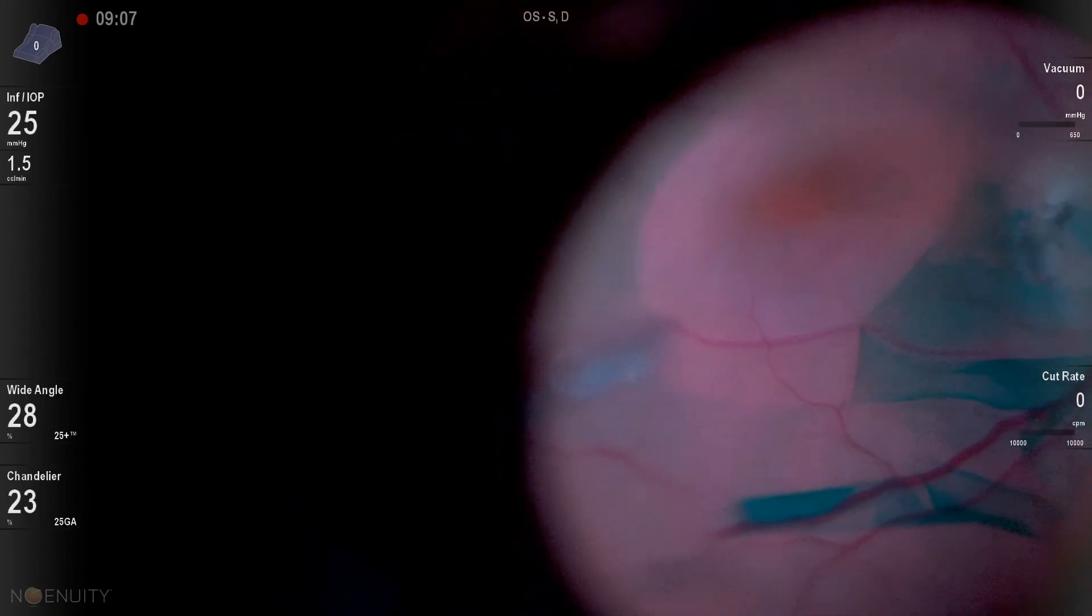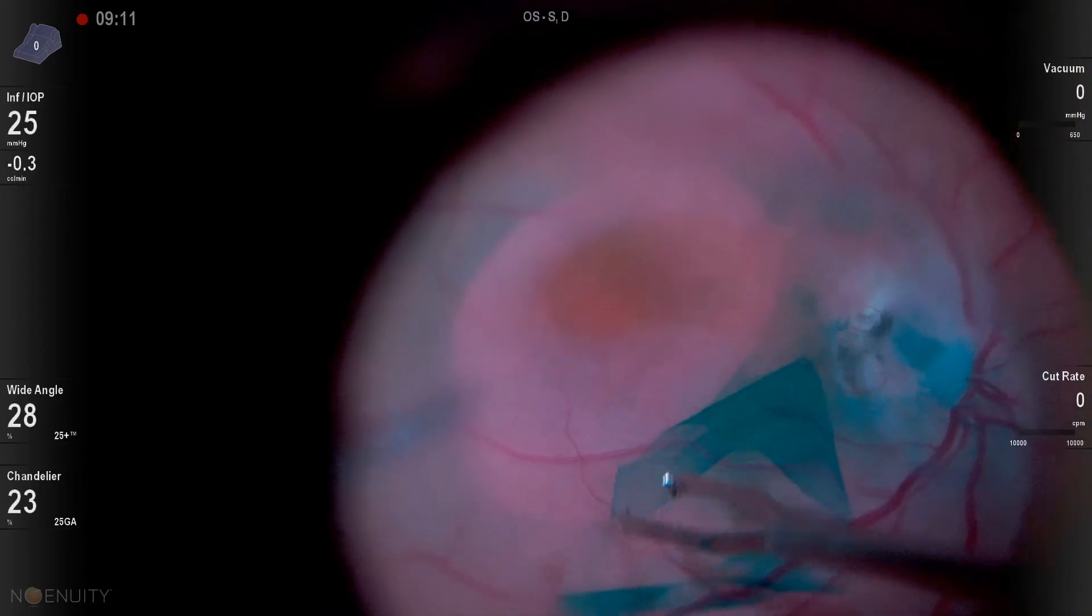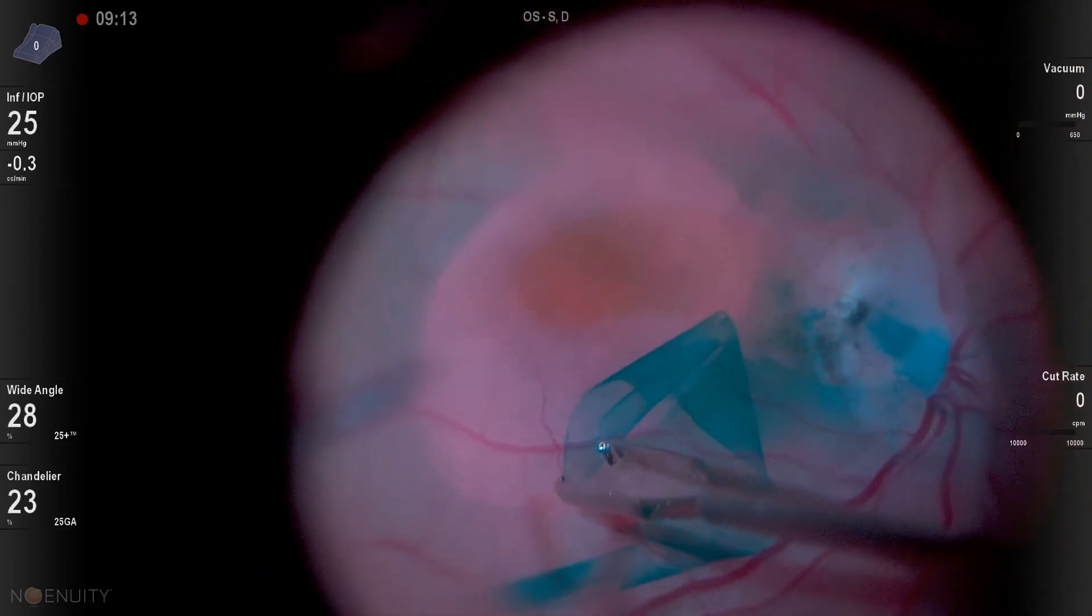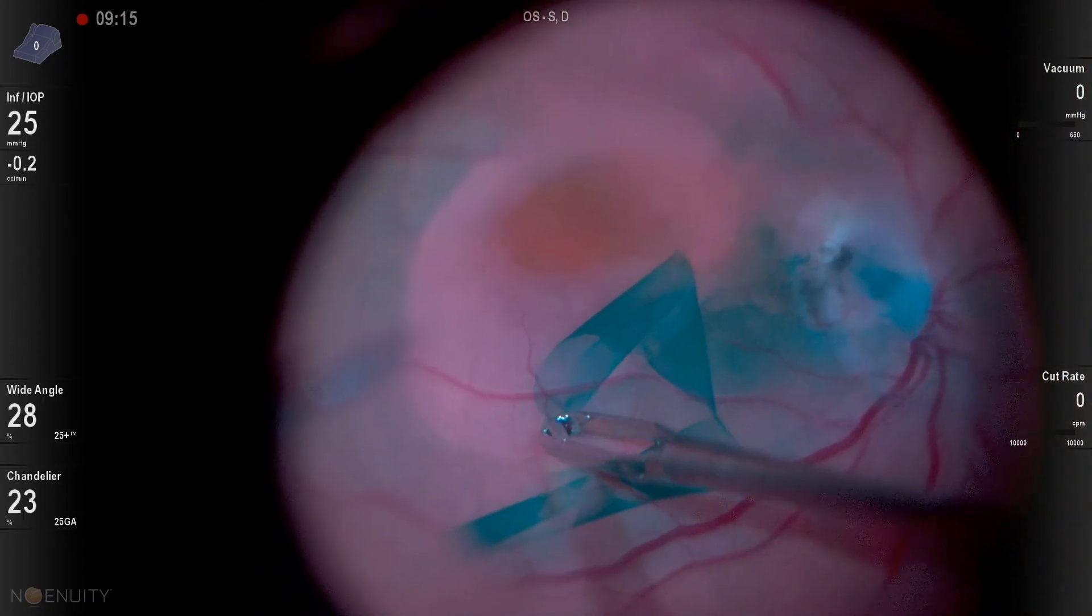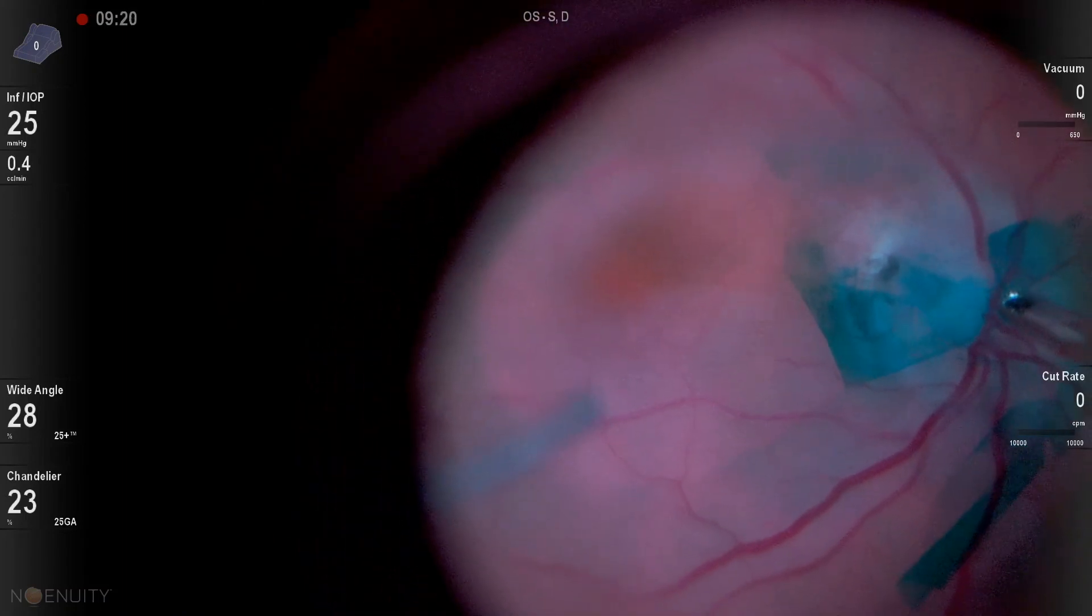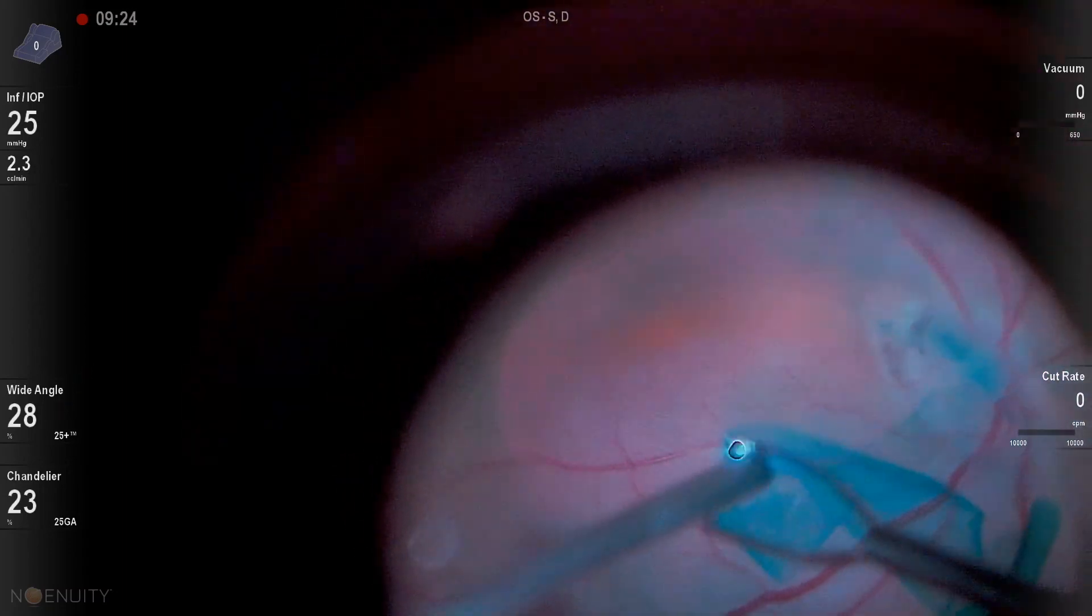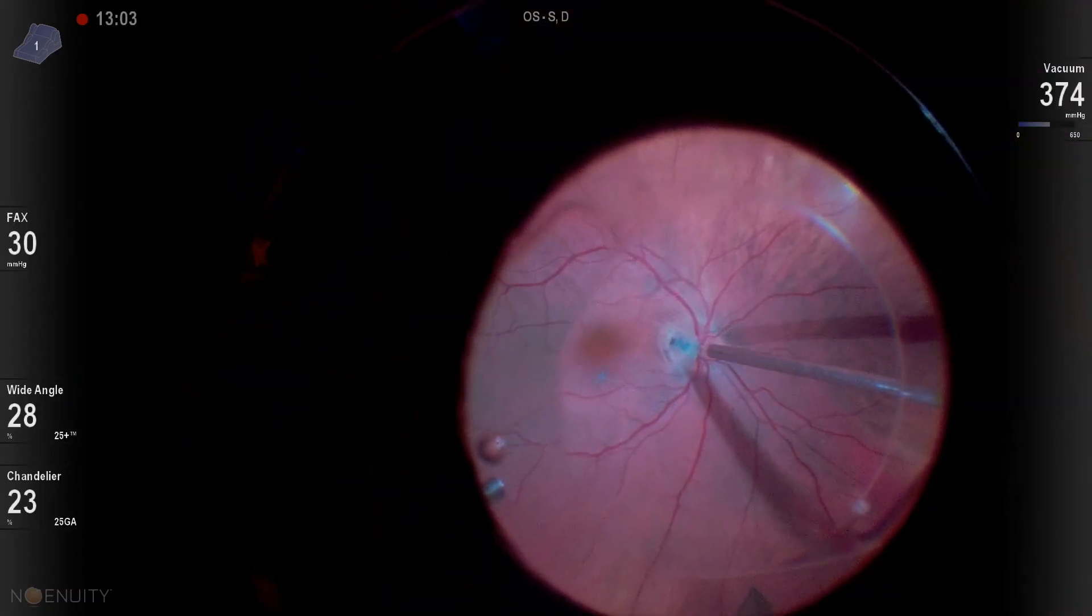Now, many people will advocate doing laser at the edge of the disc pit to just try and encourage some scarring and closure. I'm not a laser person, and so basically, I don't do laser on these cases. Here you can see I get that ILM out over the pit, and then it just kind of lyses from there.